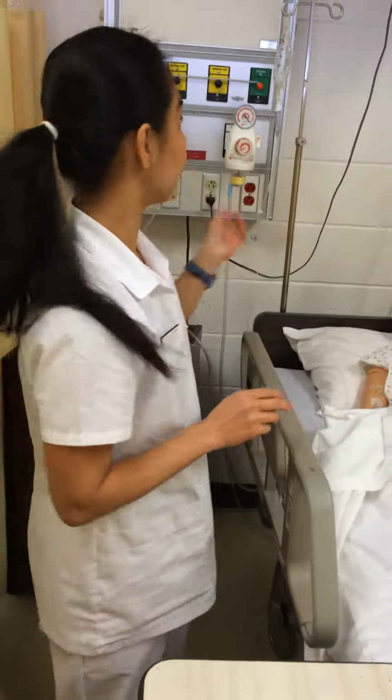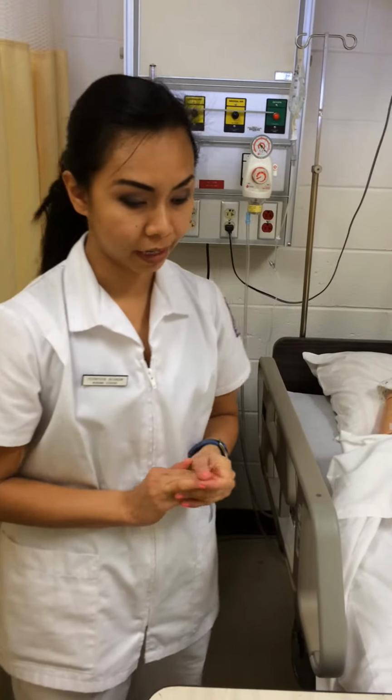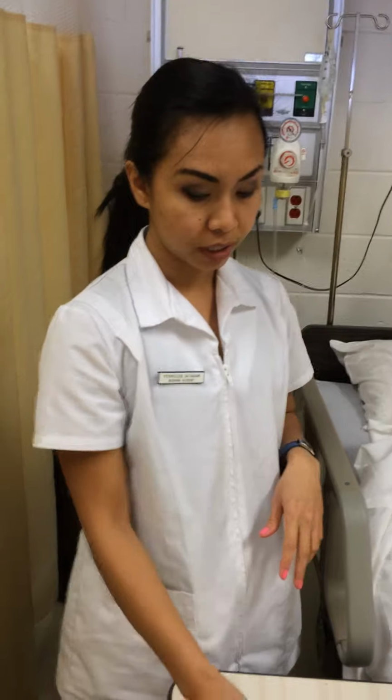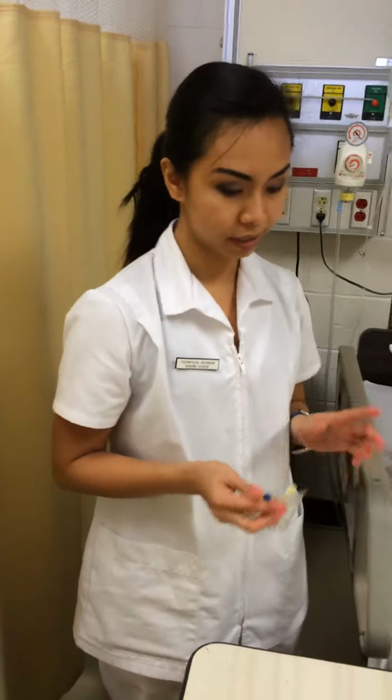So now after that, I found out that the physician wants to add medicine for the patient through an IV piggyback. So I'm going to begin with the 7 steps. First, I have to make sure it's the right patient, right dose, right drug, right time, right route, right reason, and I document.